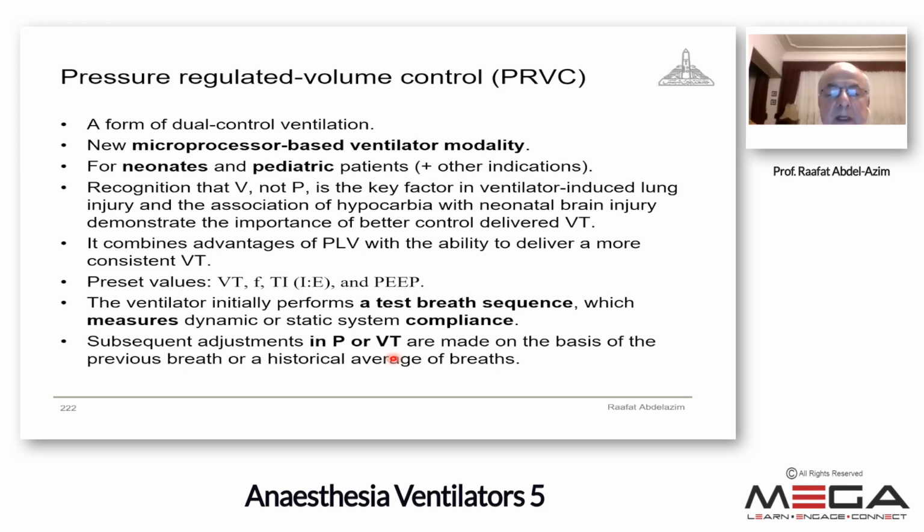But if I start immediately without having previously applied to this patient during the operation another form, if I start to use this mode of ventilation, it will undergo a test breath sequence. This test breath sequence measures the compliance of this patient, and subsequent adjustments in pressure are made on the basis of these measurements to give the desired tidal volume.